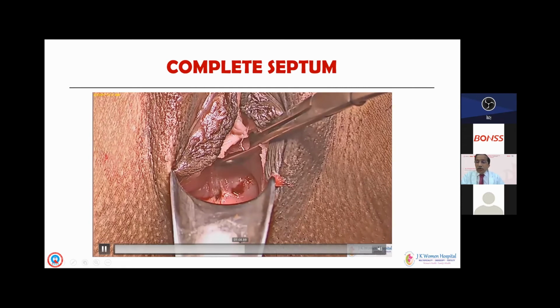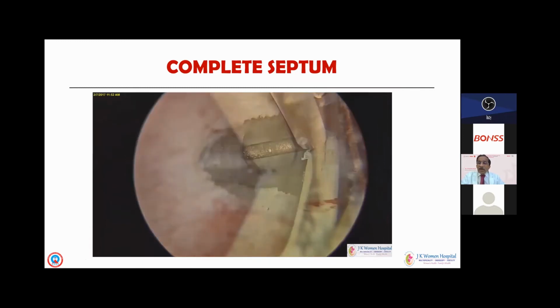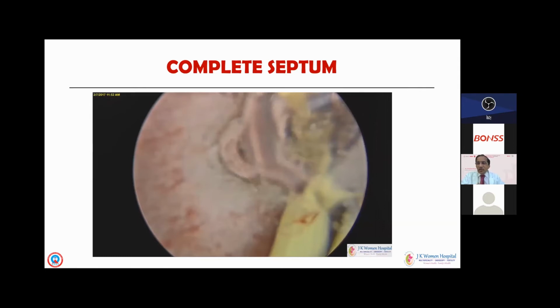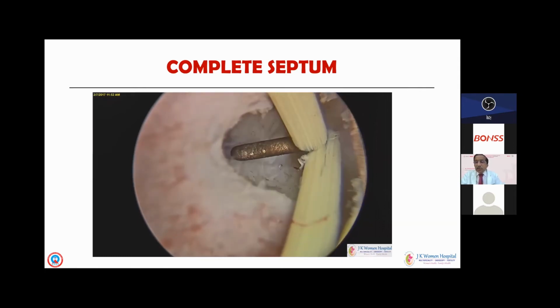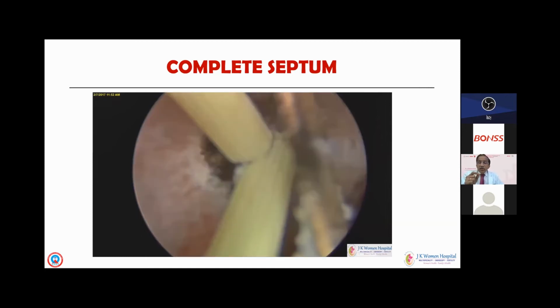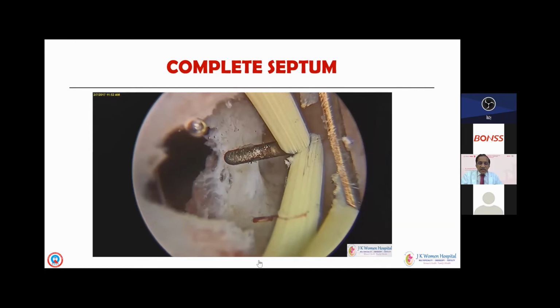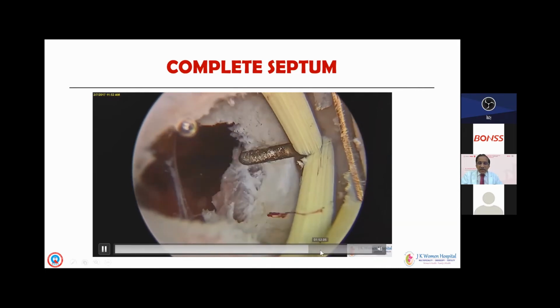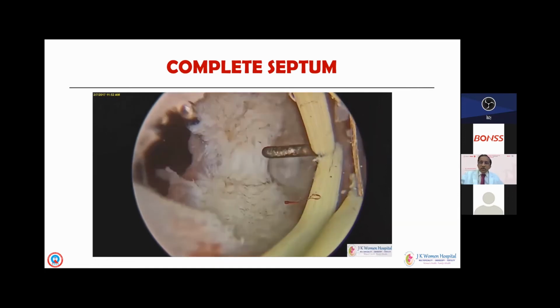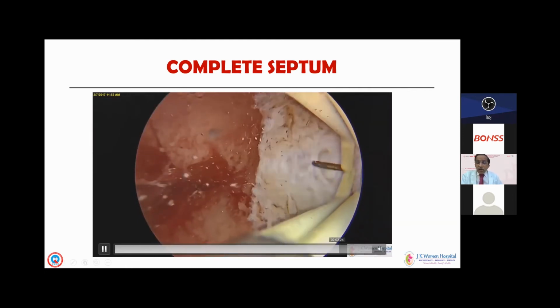Here you cannot do it with a cold knife or scissors because the septum is very difficult to cut. Well, just starting above the internal os, you perforate. Here we use the energy because this is the only place otherwise in a septum, either in a Robert's uterus or a complete uterovaginal septum, you can just perforate just above the internal os where the septum is thin with your Collins knife, and then you can see the other side of the cavity is very well seen. That means you have now converted a complete septum into a partial septum, and then you can do the same way as you saw with the help of scissors with the ostia always under vision.